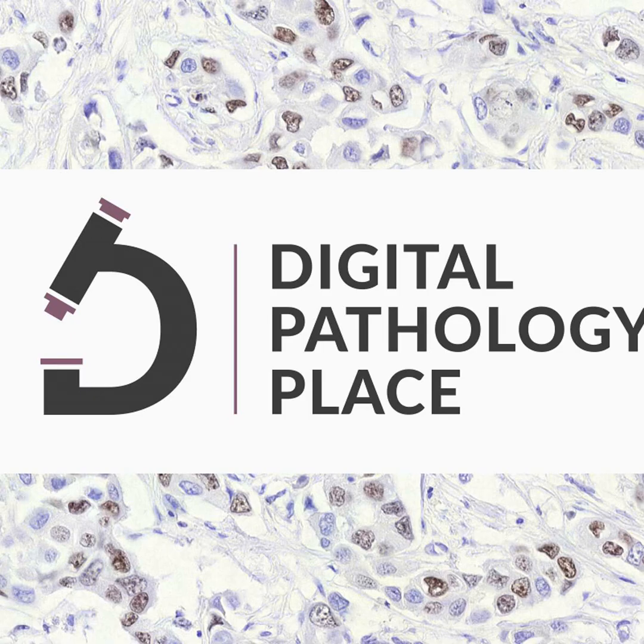So a simple baseline in this scenario, maybe that is grabbing a pre-trained model. Doesn't even have to be pre-trained on histology. So that means it's been trained for some other purpose on some other type of imagery. It's not tuned to histology necessarily, but you can still apply it to extract features. And then you'll get some features from each image patch, and you have your annotations for each image patch.